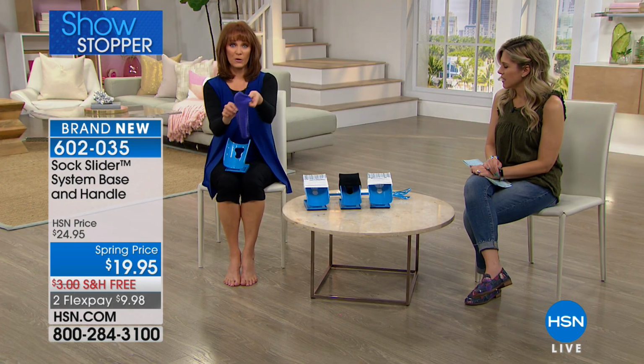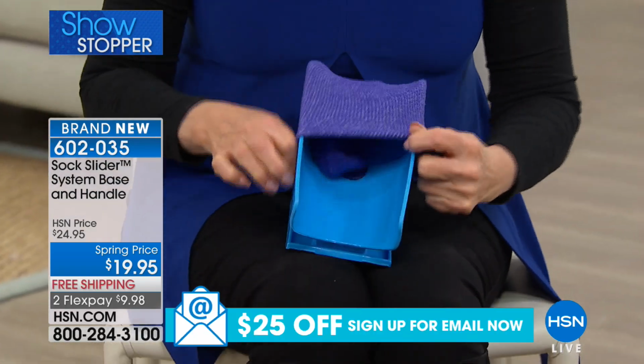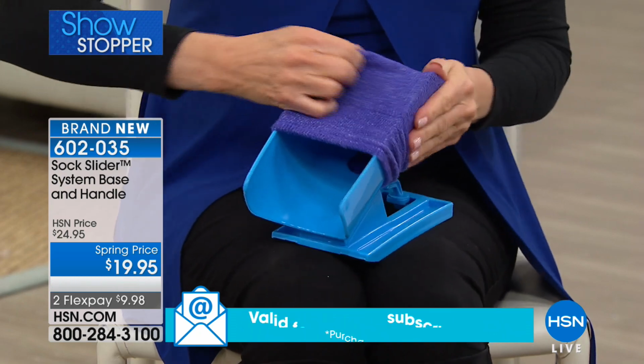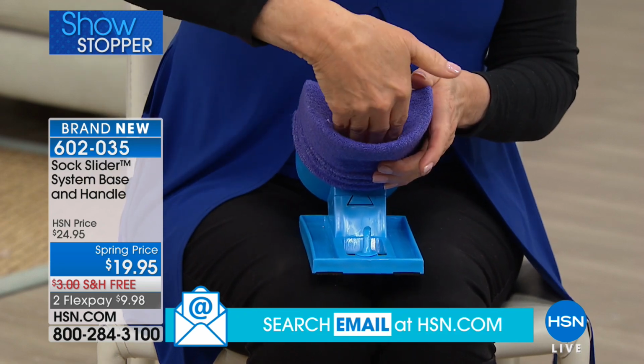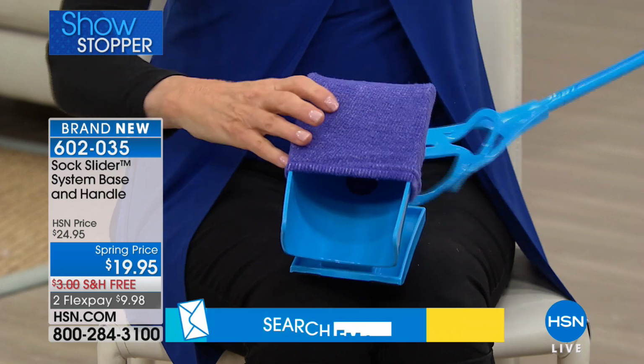So you're going to take it with your heel down and come up the top, right? And I'm going to come over and you roll it down until your toe, you see your toe right there, is right up there to you, because you want to meet it and send it back in. Now, I'm going to show you a bunch of different socks, but let's show you this one again.